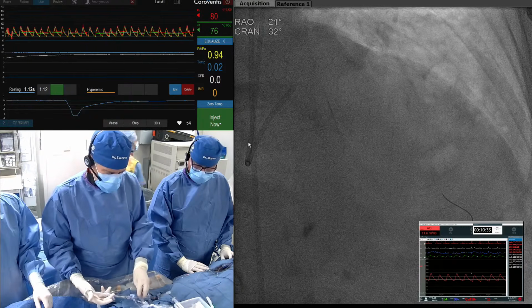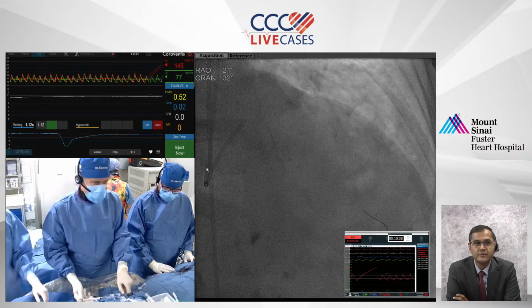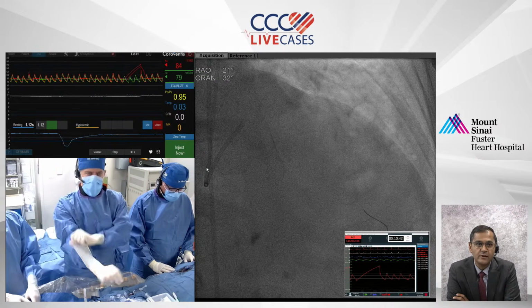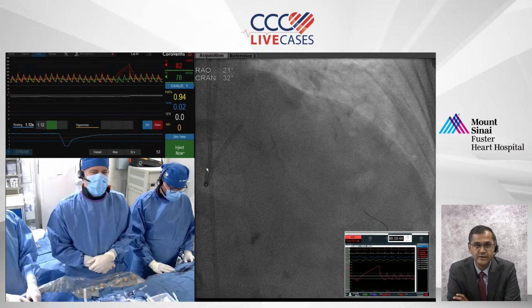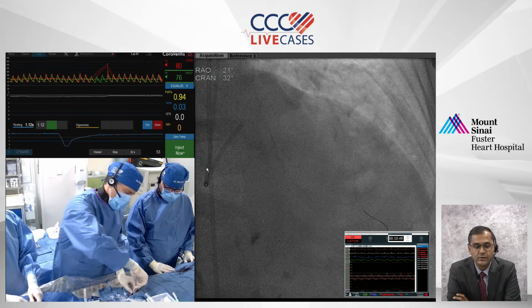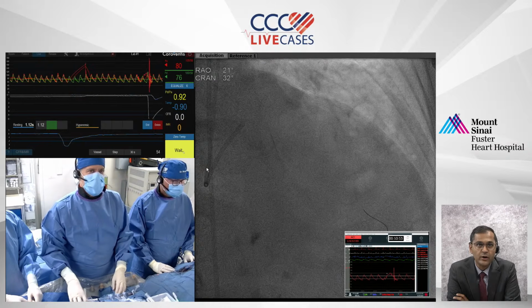We haven't. We're going to, for clinical trial purposes, start doing it. But the challenge is that you need specialized equipment that's not reimbursed. And so you need a specialized microcatheter and then to connect it to a microinfusion pump for a saline injection. Yeah. So I think with bolus thermodilution, the nice thing is that you can do this in almost any cath lab. You don't really need anything specific other than this wire.